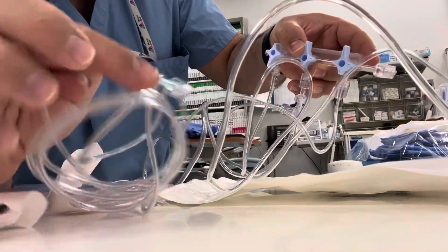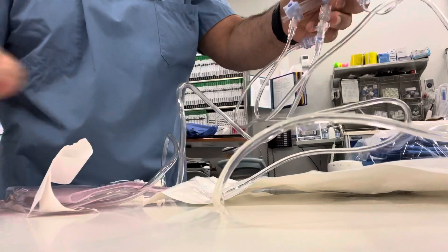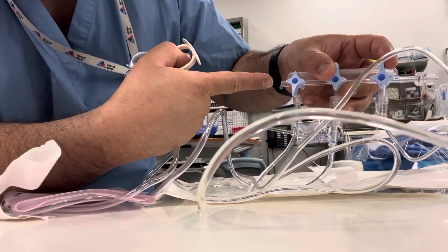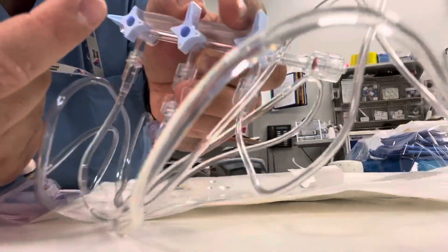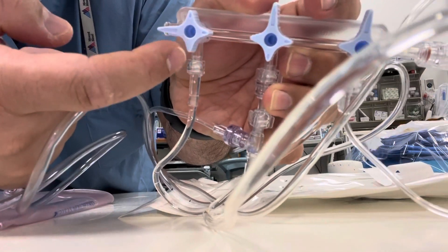The last, third tubing goes to the transducer. As soon as you see the contrast dripping out, you close this. As you can see, this says 'off' — if this is off, nothing will go in from here.